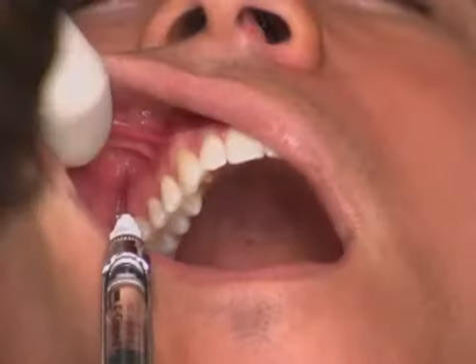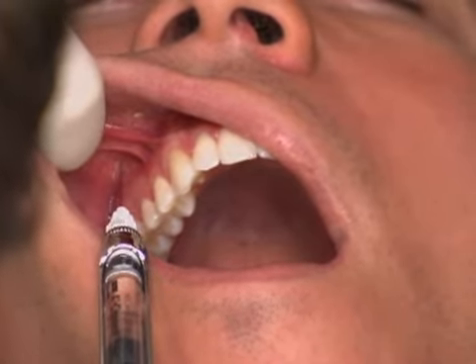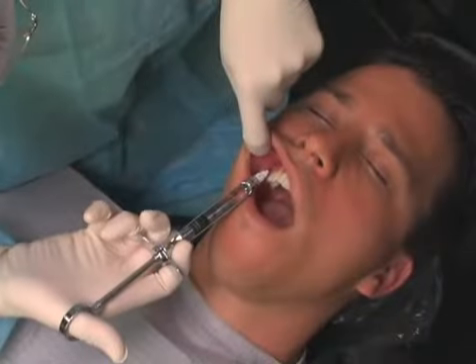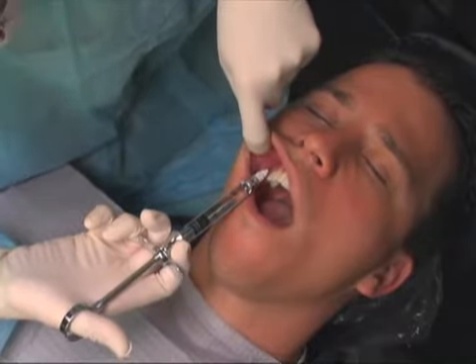The insertion site is the height of the buccal fold adjacent to the maxillary second premolar. The needle is inserted until its tip is located well above the apex of the second premolar. After 2 negative aspirations, a half a cartridge of local anesthetic is slowly deposited.